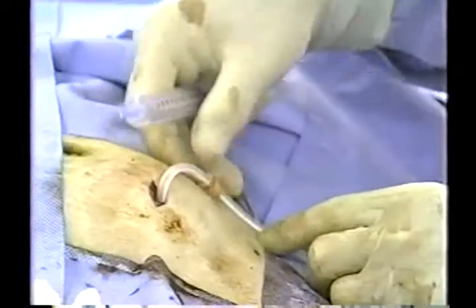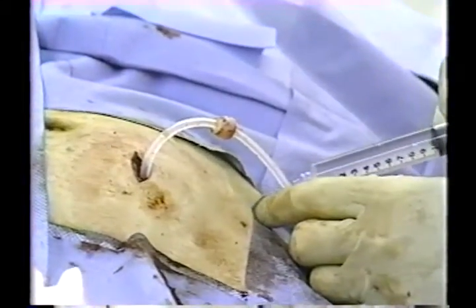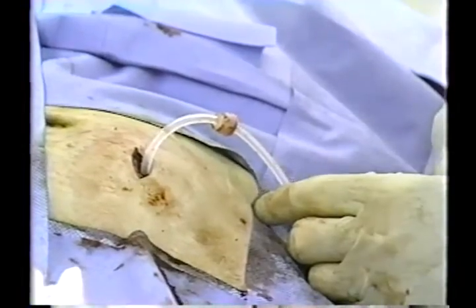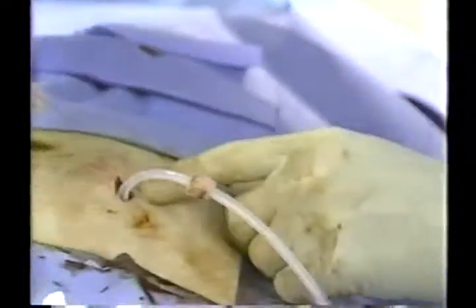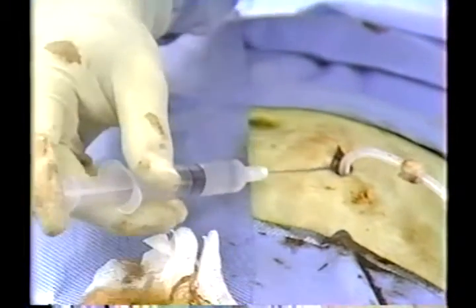The desired skin exit site is determined by laying the catheter on the skin and marking a site 2 centimeters distal to the exposed subcutaneous cuff. The exit site is then anesthetized with 2% lidocaine. A longer spinal needle is inserted along the desired tunnel path to provide adequate anesthesia.